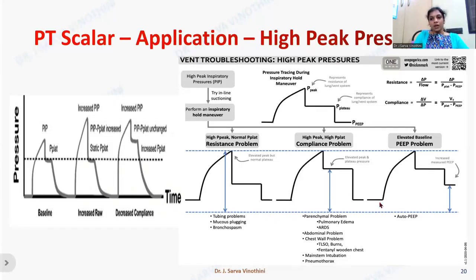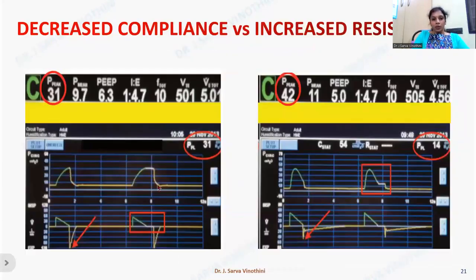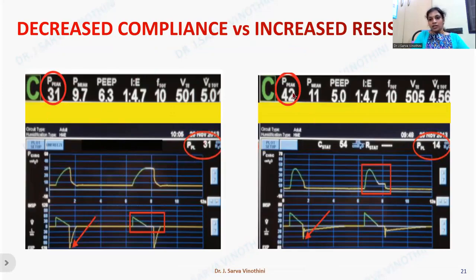An elevated baseline could also be due to auto-PEEP, so look for auto-PEEP if all other causes are normal. For example, if peak pressure is 42 and plateau is 14, the plateau is normal but the difference is large — suggesting the increased peak airway pressure is mainly because of increased airway resistance. Conversely, if peak and plateau are both high with almost zero difference, the issue is decreased compliance.